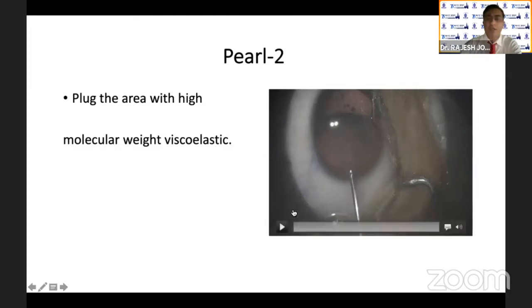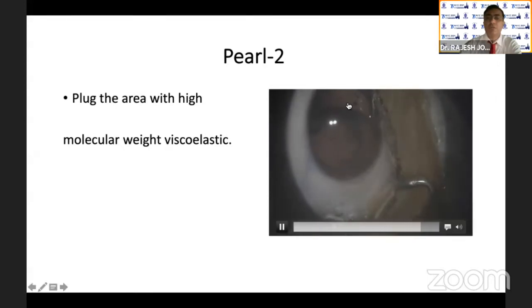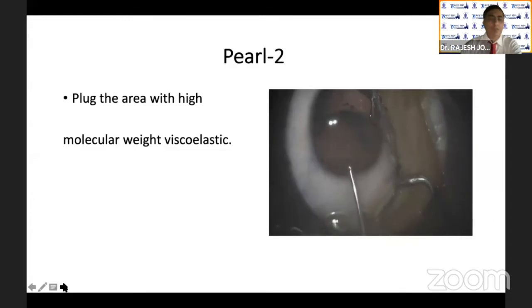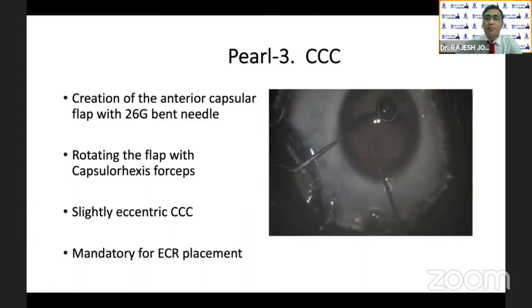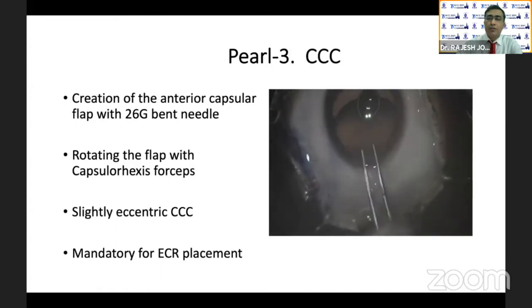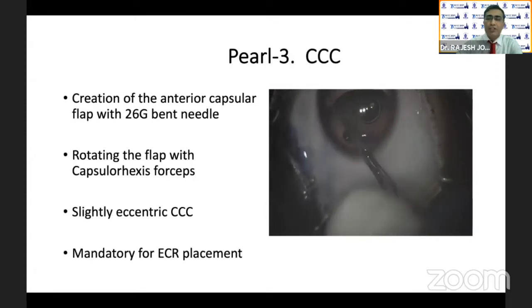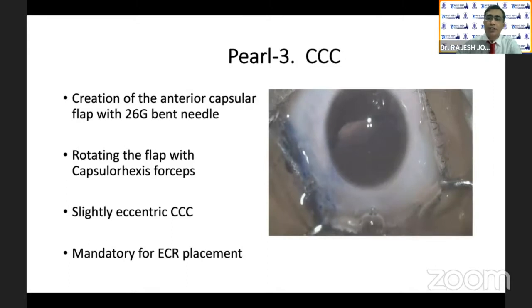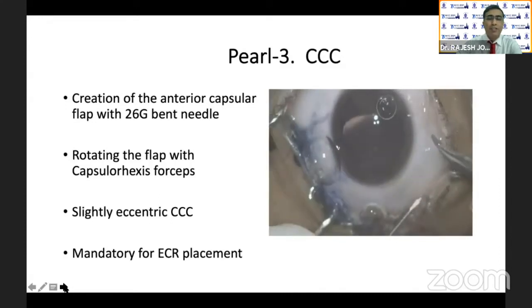Pearl number two: plug the area of dehiscence with high molecular weight viscoelastic to prevent vitreous loss. Pearl number three is CCC, which is mandatory for placement of the endocapsular ring. Creation of the anterior capsular flap with a 26-gauge bent needle is important — pinching the capsule can further compromise the zonules. Rotate the flap slightly eccentrically so that once you pull the bag with the capsular tension ring or capsular hook, the capsular axis comes into the center of the pupil.